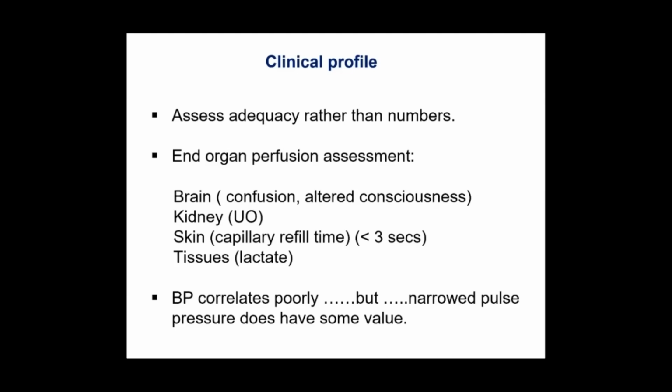Before these windows are revealed, it is better to preempt the diagnosis, use advanced hemodynamic monitoring, and optimize the hemodynamics and homeostasis before these windows start deteriorating.